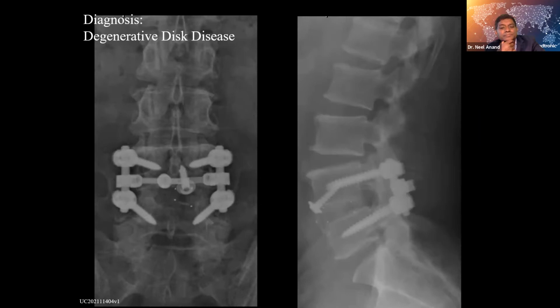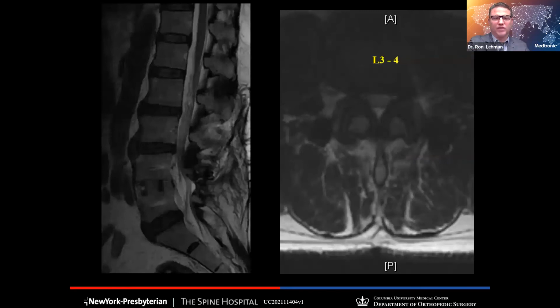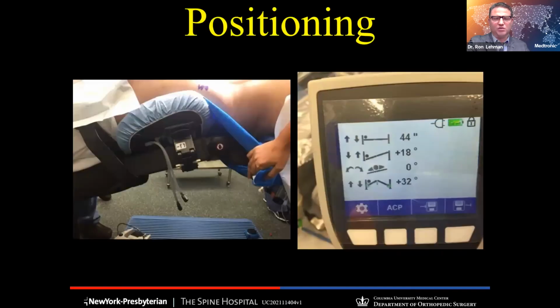Yeah, I think these points are really germane for us to look at as surgeons. We certainly see retrolisthesis, and we know that's basically the one sign that the X-ray gives us that says the patient isn't able to stand up as well as they need to, and they're really trying to compensate for this. Foramen obviously becomes much smaller, and this patient's actually really hyperlordotic at L3-4 because they're trying to make up for the lost lordosis at L4-5. Our MRI shows us that they have the typical adjacent segment stenosis, and also some degeneration at L5-S1, but with a combination of injections, we really ferret out that the 3-4 is the problem.